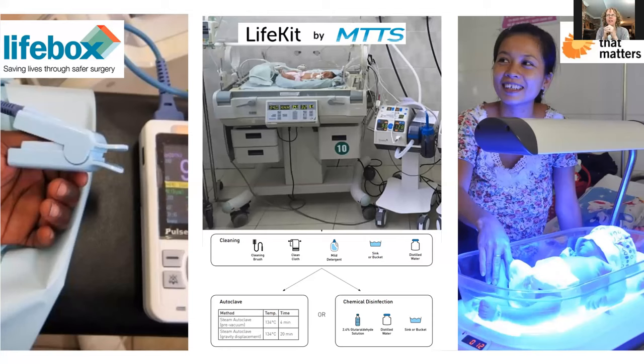Another example is a great social enterprise called MTTS in Vietnam. Design That Matters has worked with them to commercialize the Firefly phototherapy device. They also have a device called a CPAP, which is for newborns with respiratory distress. One of the things they saw is that the tubing that's used for that respiratory therapy is often reused, and that can pose some kind of a cross-infection risk. So one of the elements they included in their product is an ability to reuse and clean those tubes.